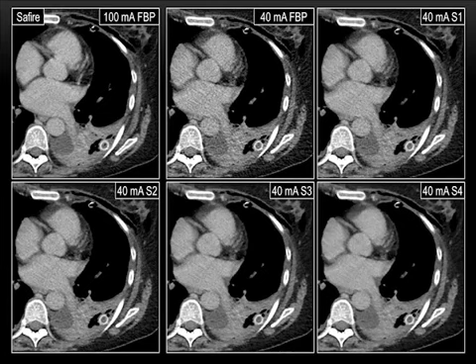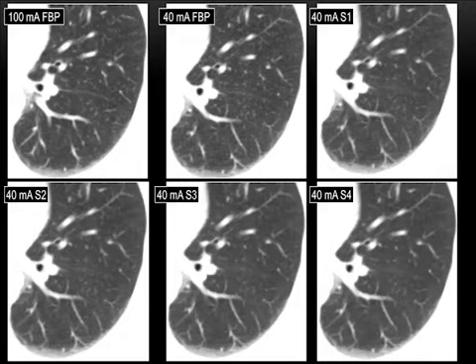And when we do any sort of analysis, or subjective analysis, when we show these images to a radiologist, I think the most important thing is they want to see that, okay, noise has gone down in the mediastinum in all these structures of the heart, but they want to see the edges as sharp and crisp as this one. Only then can they call these two images comparable. So the message here is IR does reduce noise, but be careful to look at the visibility of tiny structures and the edges. And let's look at an example of a chest CT.